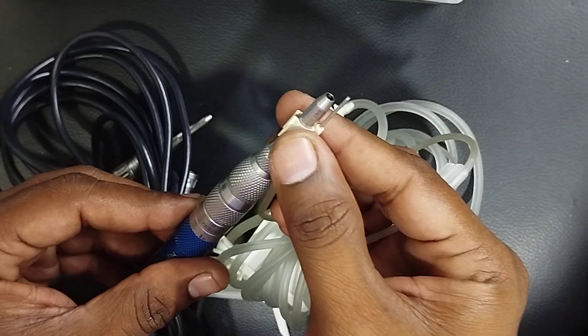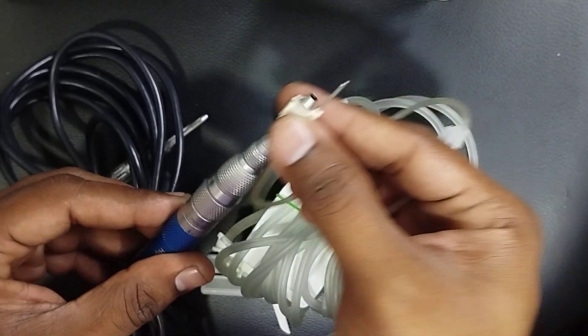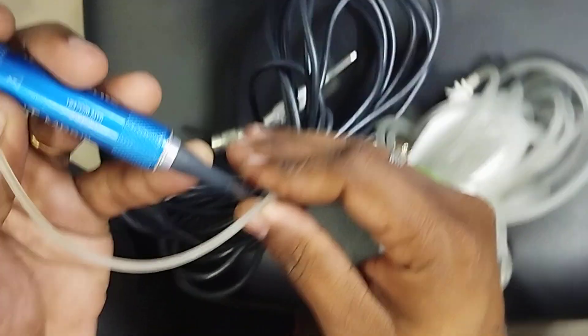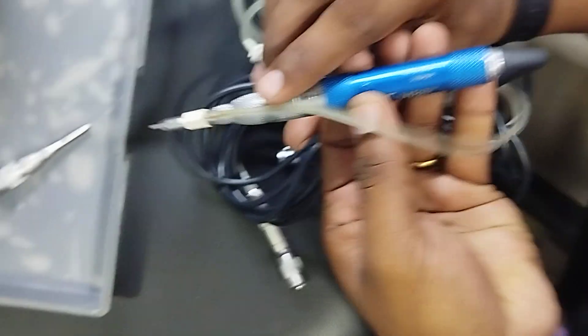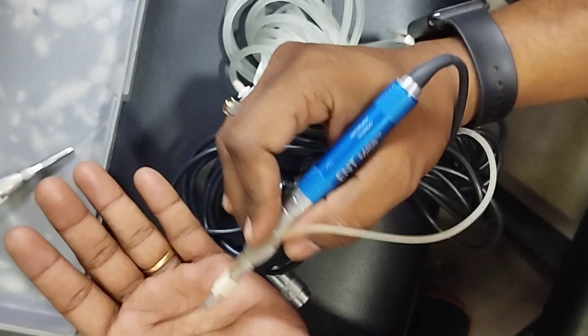When you want to disconnect, go forward in the same way and simply remove it. There is also an additional adapter to help hold the tube in place. If you feel the tube is causing disturbance during the operation, you can use this adapter to combine them together, so during operation it will stay secure. Thank you.